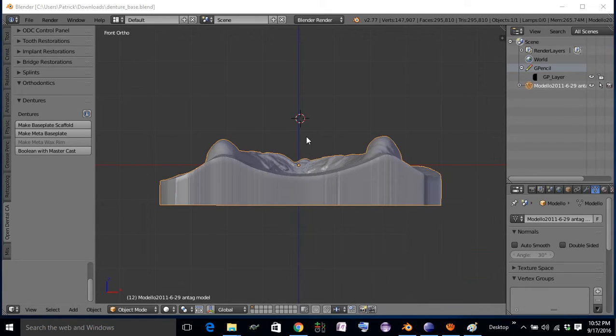I'm going to demonstrate the new features that I implemented into OpenDentalCAD that are based on the techniques I highlighted in the last video about making a denture base.